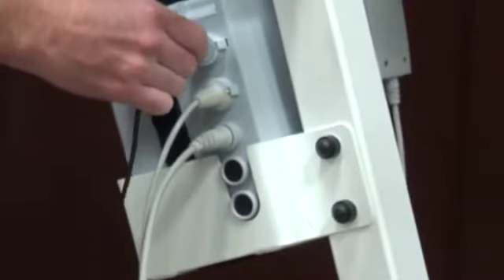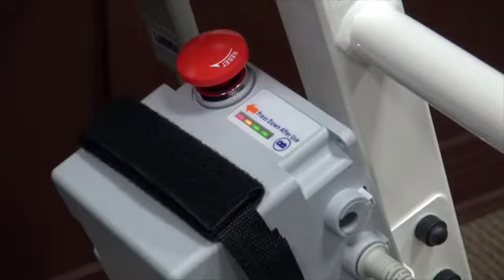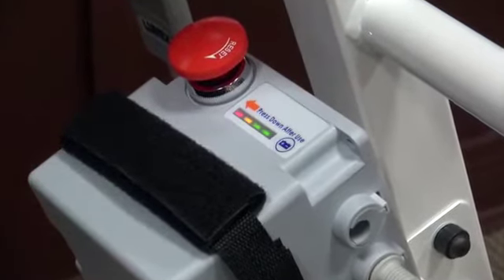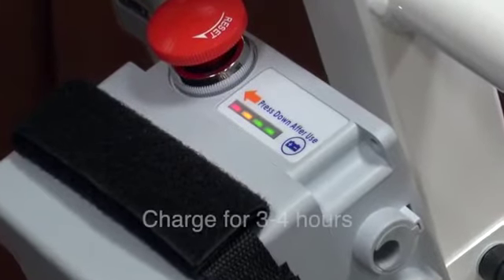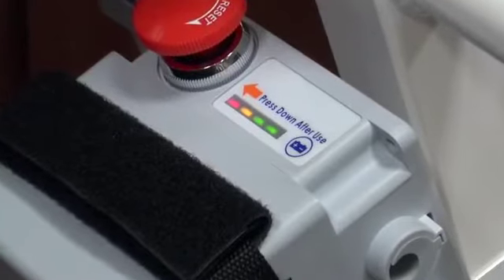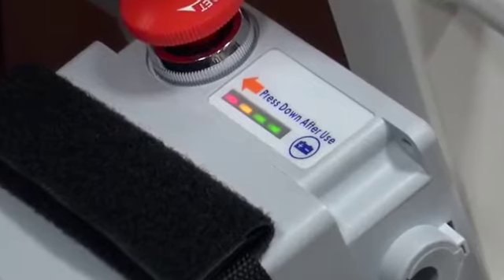The charger plugs into the top opening. The lower two openings are not used. By pressing the battery testing button on the control box, the remaining charge will be shown. When the red light glows, you must recharge the battery. You will also get an audible low voltage warning beep for a low battery charge. Recharging takes three to four hours from one green light.